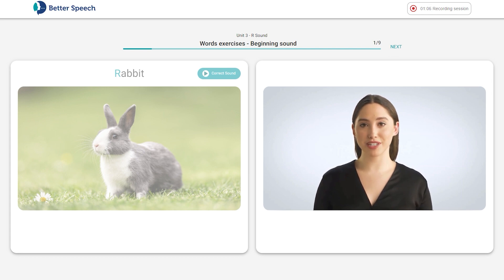First, you will see a single word on the page and hear a short recording of how the word sounds like. At any point of this exercise you can always click on the correct sound button to listen to the correct pronunciation. Then once the countdown — three, two, one — ends, say the word slowly and clearly three times.